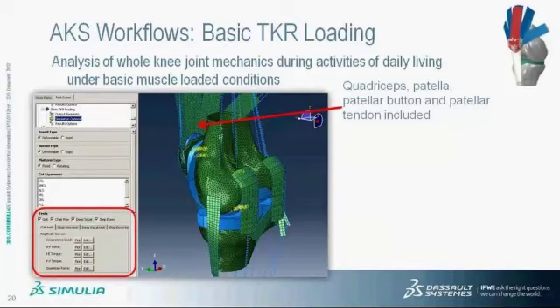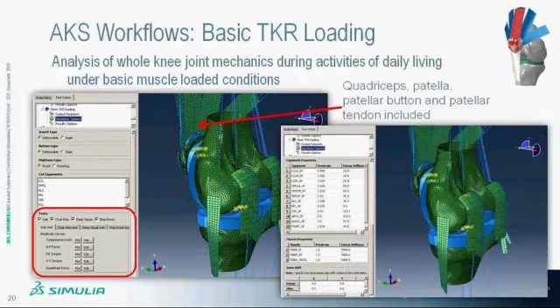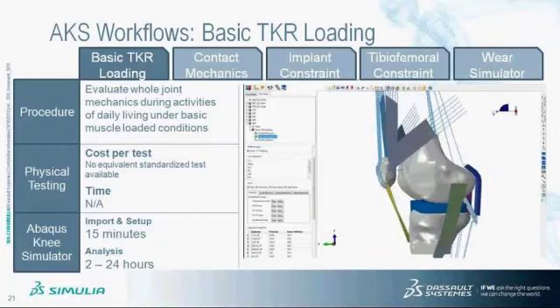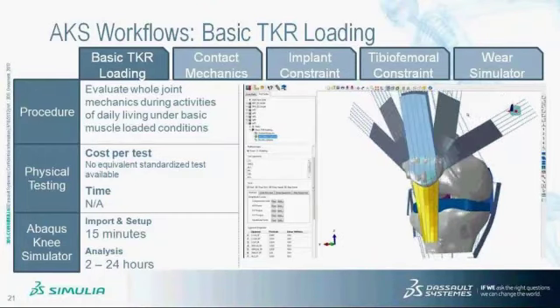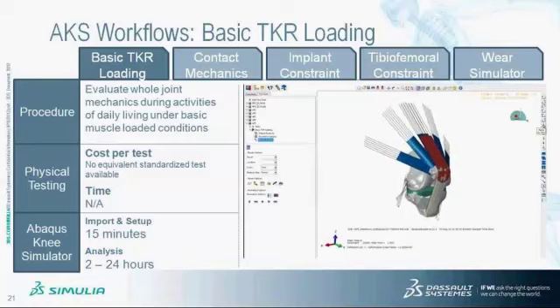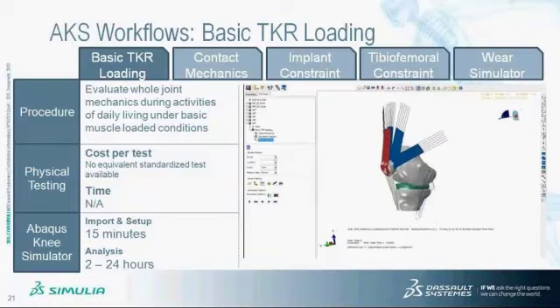A number of daily activities are provided as built-in loading conditions that include the gait loading condition, chair rise, deep squat, and step-down loading conditions. Provided with the muscle property is again the ability for the user to change the pre-strain and the linear stiffness of the muscle. Again, for the basic total knee replacement loading workflow, because a whole joint is required for the physical testing, the time and the cost for running these tests is very prohibitive for design evaluations.